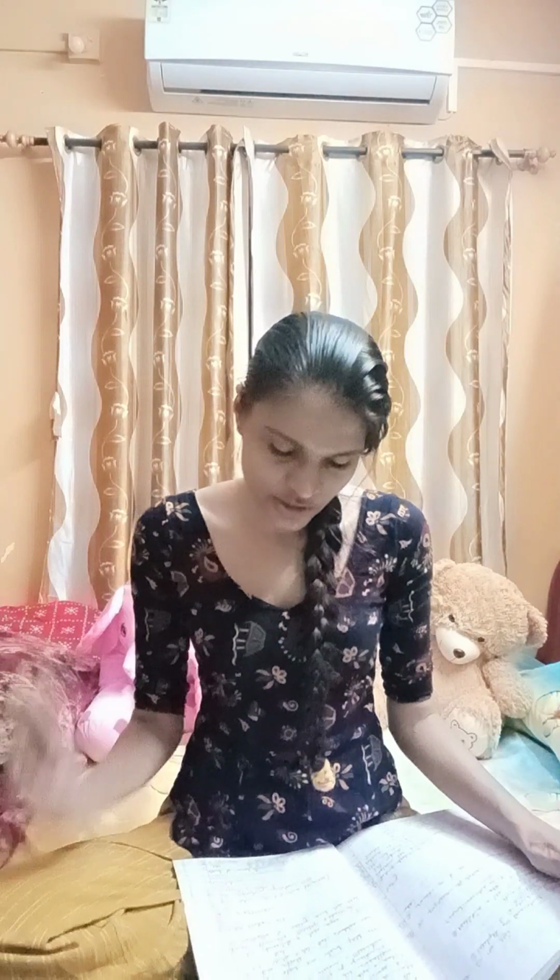Second, both the eyes should have central fixation, no anomalous retinal correspondence. Then no suppression, and there should be good vision in both the eyes, no poor vision, and no color blindness for red and green colors. The patient should be given full refractive correction, as the test is carried out at a distance of 50 centimeters to 1 meter. Fifty centimeters is used in this chart. So these are the prerequisites: central fixation, no anomalous retinal correspondence, no suppression, good vision in both eyes, no red-green color blindness, full refractive correction, and a cooperative patient.